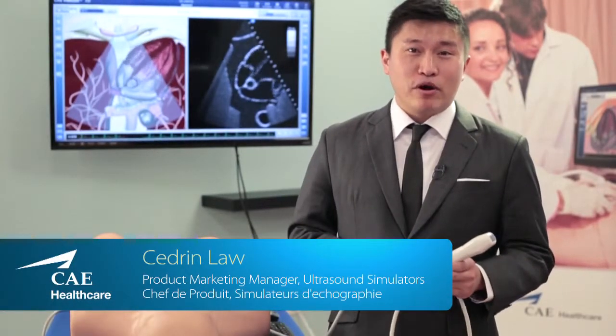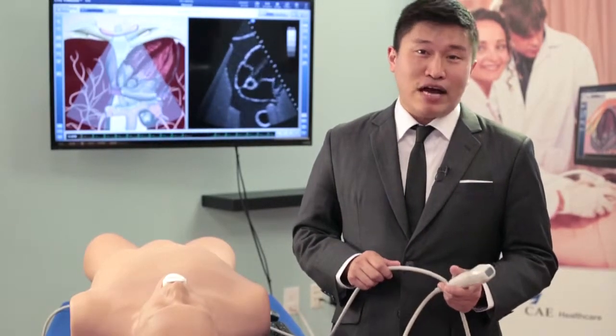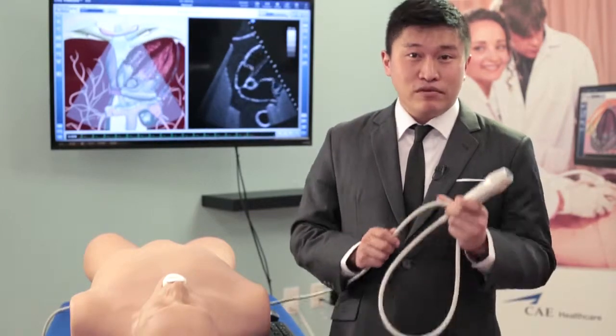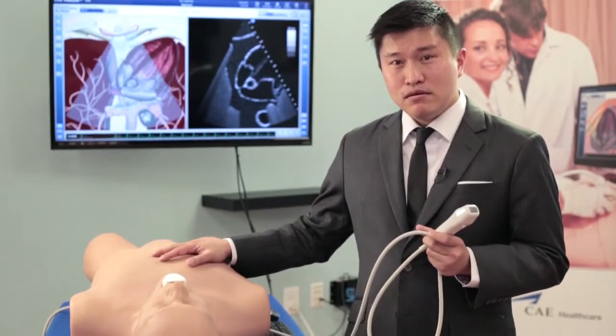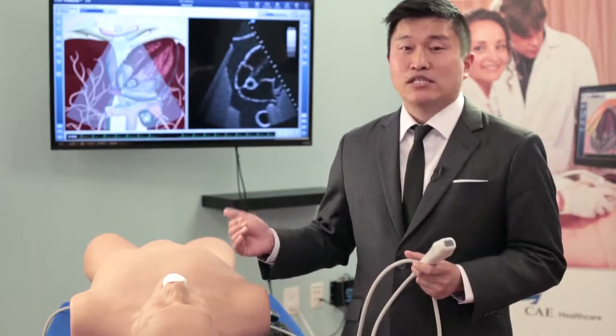Biomedics is the most elegant and comprehensive ultrasound simulator on the market. It's really useful for making learning ultrasound easier and faster. The system is elegantly simple — it consists of a probe, a mannequin, a computer, proprietary software, and excellent content.